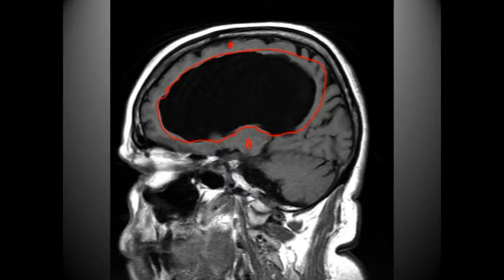So we're looking at a significant loss of brain matter, and it is always debatable whether this patient would have adequate cognitive skills or not, just due to the amount of brain space that is lost due to the accumulation of cerebrospinal fluid. It would be very interesting to see how this patient functions in normal life, just simply because of the affections as well.